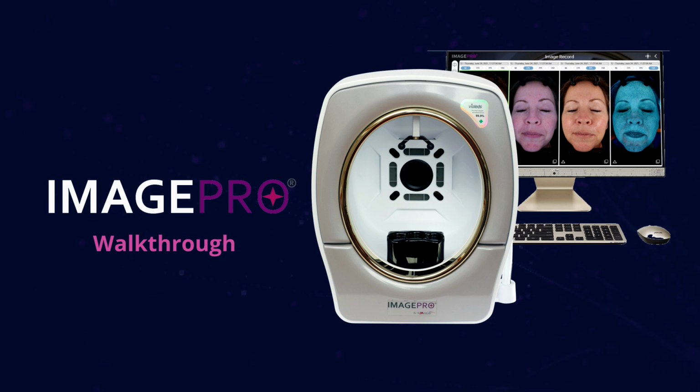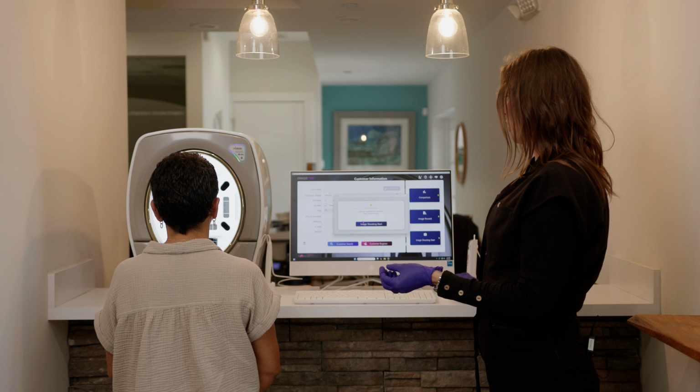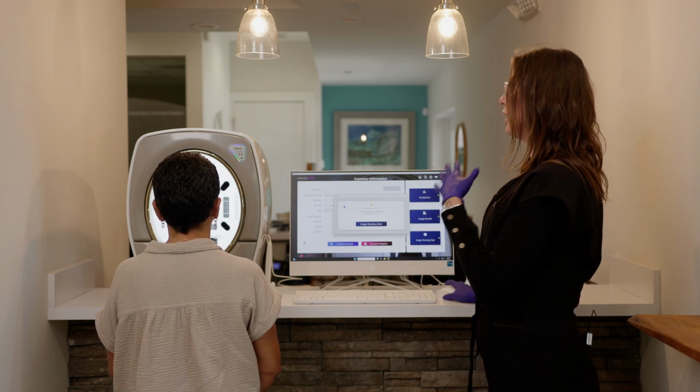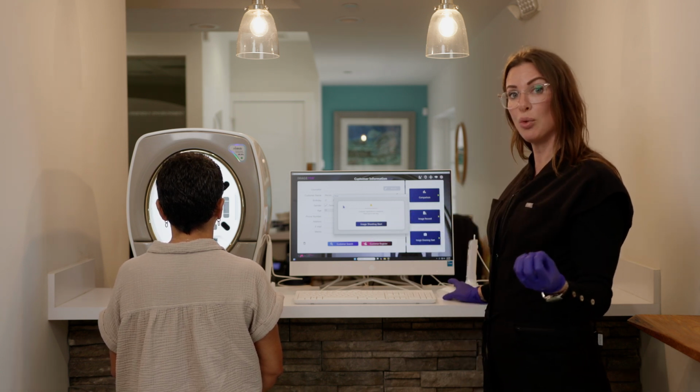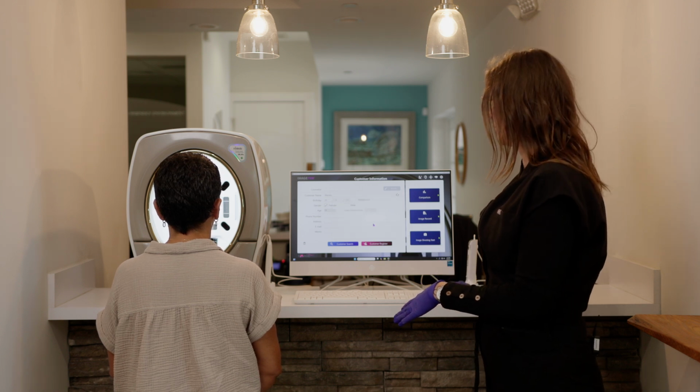I am going to show you kind of the dynamics of getting a facial analysis done. So we've entered her information. Name and birthday are the most important. You can add as much or as little information as you want. We're going to start the shooting.